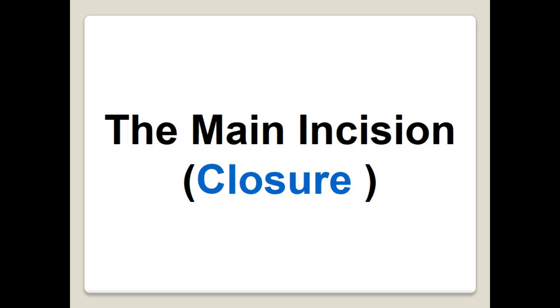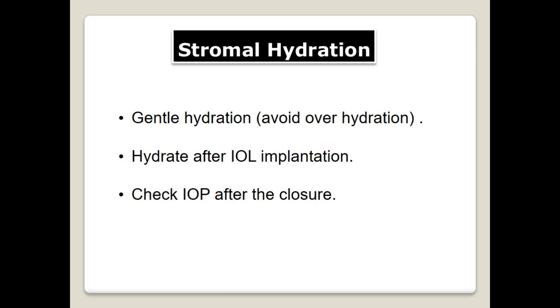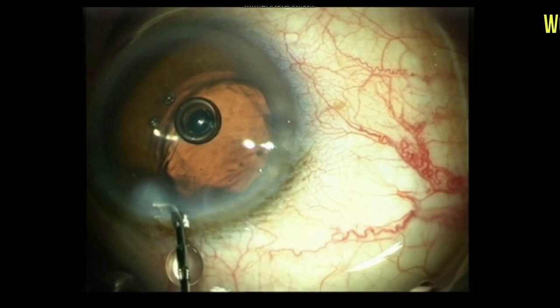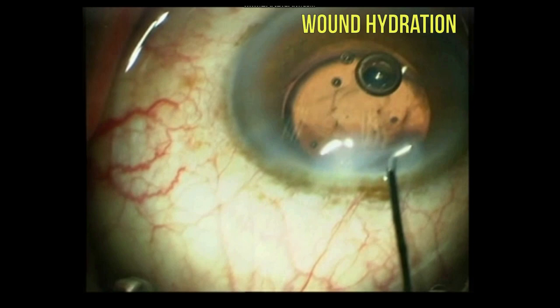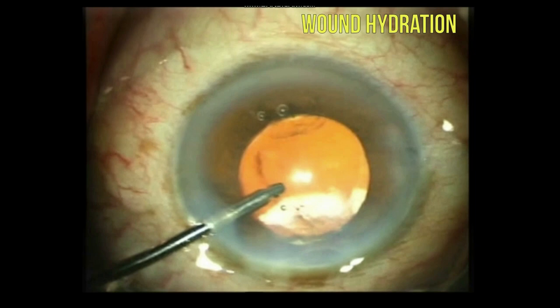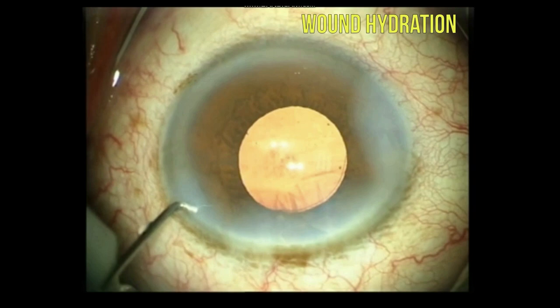Wound closure is achieved via stromal hydration. This hydration causes apposition of the wound roof and floor, and the hydrostatic forces of the corneal endothelial pump help seal the incision. Hydration should be gentle, using a 27-gauge cannula. At the end of the operation, always ensure the eye is well-formed; you can feel the intraocular pressure digitally with your index finger. This video demonstrates stromal hydration. It is better to hydrate the main incision directly after intraocular lens implantation and before viscoelastic removal, as it is easier and the anterior chamber is more stable.